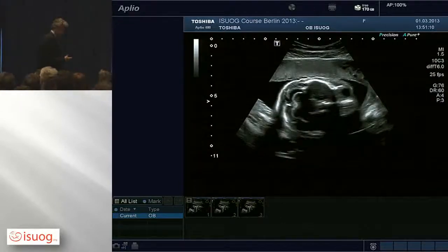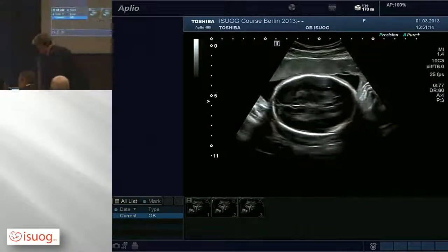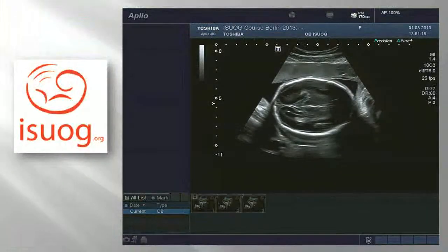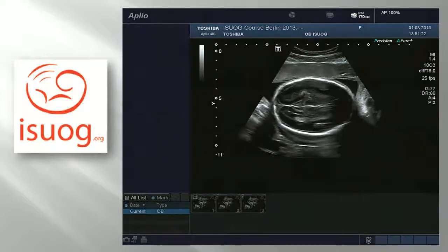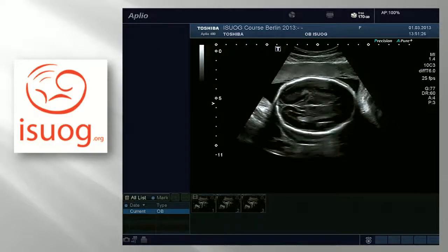Okay, I'm online? Yes. Okay, so hello again. I want to start and show you the features for a diagnostic of orofacial cleft. I start here.